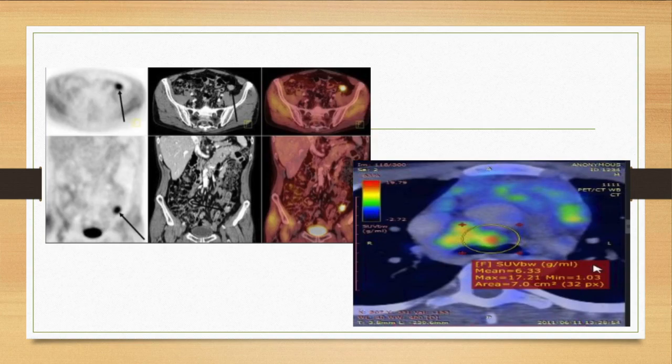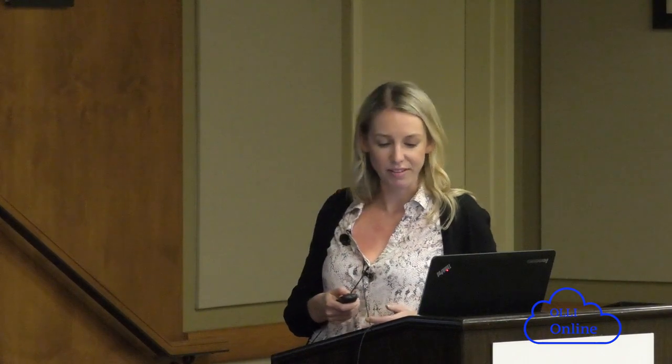One other thing you may hear radiologists talk about with a PET scan is what's called an SUV value. Basically, that's just a fancy grading system. So does it take up more? It has a higher SUV value, or if it takes up less, there's a lower SUV value. That's particularly important with lung nodules. Sometimes it's hard to discriminate if it's a benign or malignant nodule, so we use the SUV values with different cutoffs to help us determine.